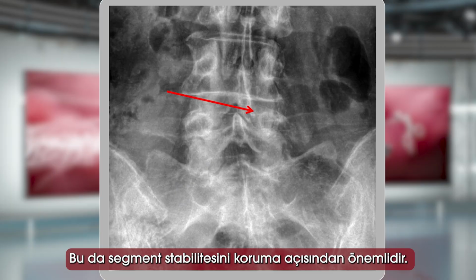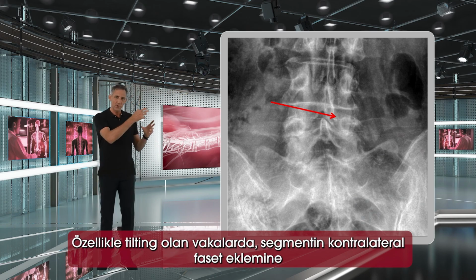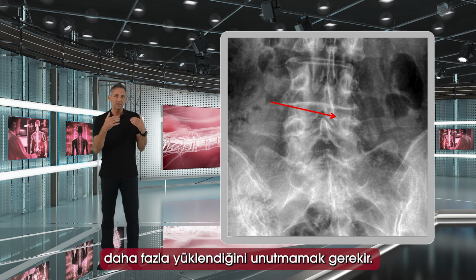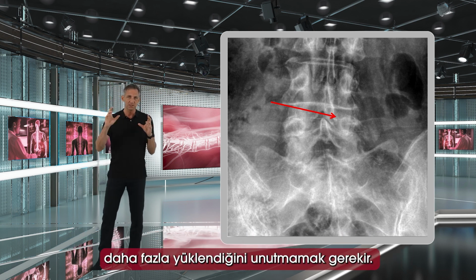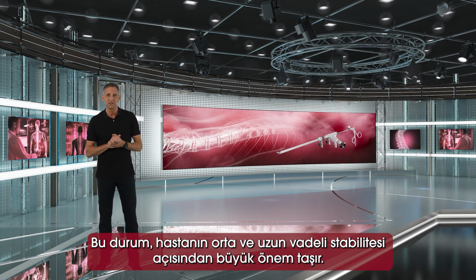And this, again, is very important because in cases of tilting, for example, the segment is particularly resting on this facet joint of the contralateral side. So in the mid and in the long term for the patient, this is very important because it will help you to preserve this particular segment's stability.